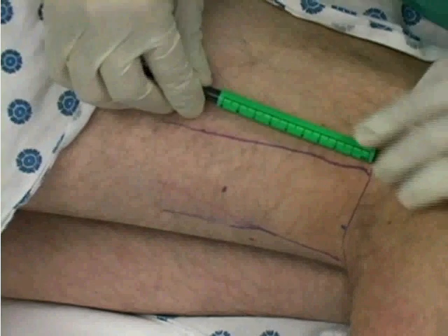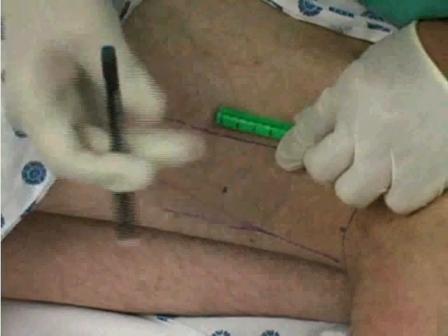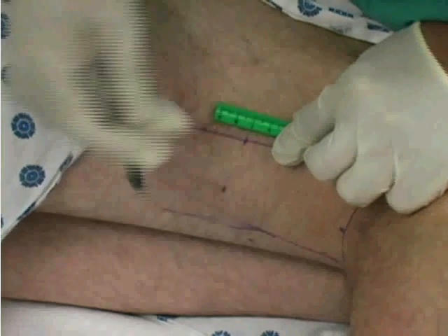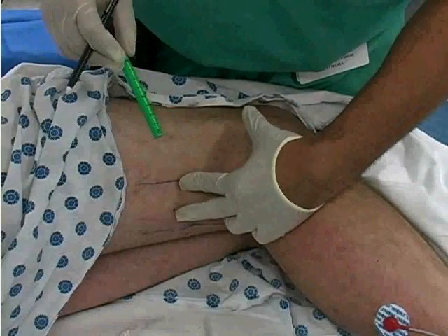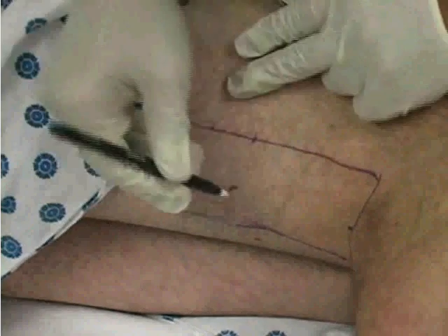Using your ruler, make a mark seven centimeters superior to the popliteal crease along the border of each tendon. Identify the midpoint between the two markings. This will be your point of insertion.